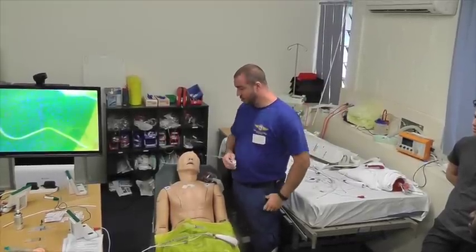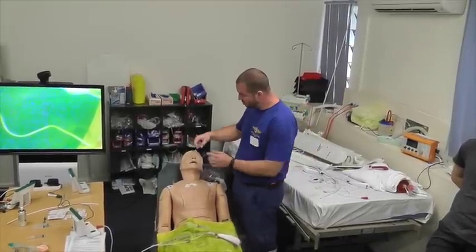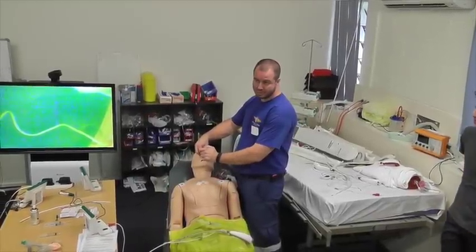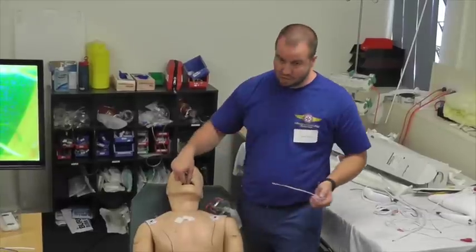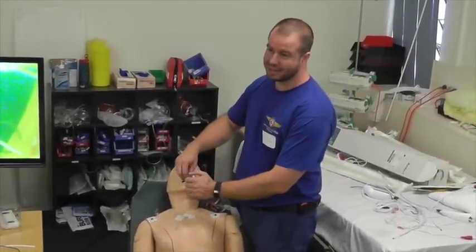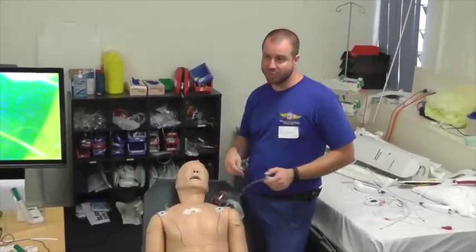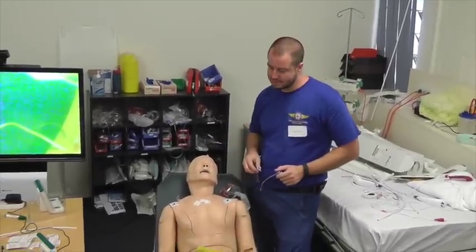So what I'm going to do is spray the nose, and I'm going to go back further into the back of the nose. And if possible, some people like spraying the back of the throat. You just have to be aware of your total cumulative dose of local anaesthetic.